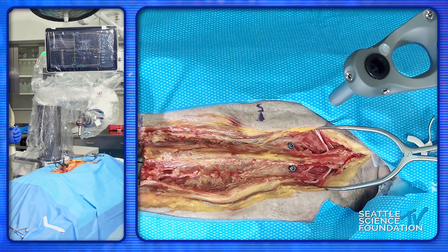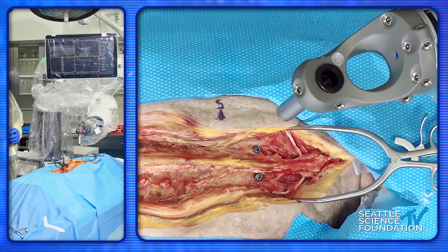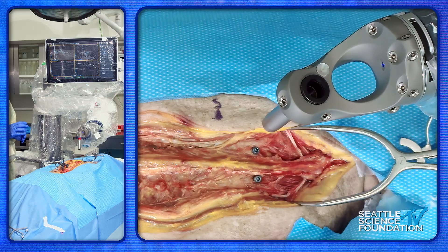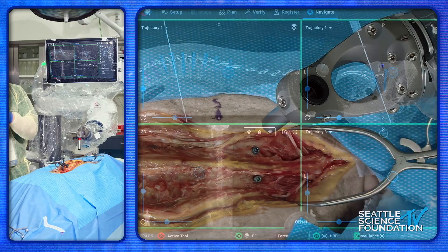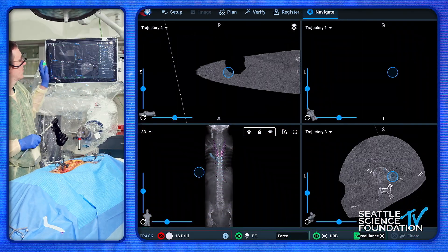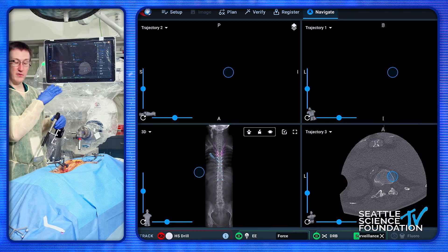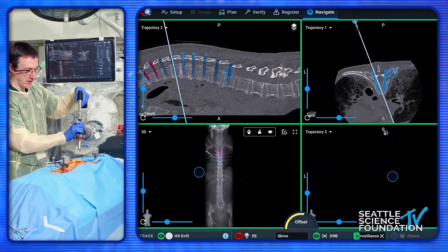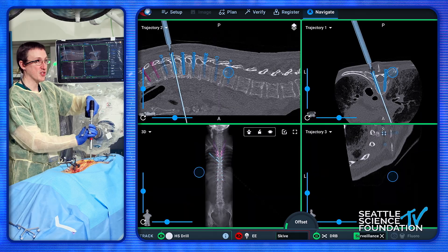There are times where the patient will be moved enough that you'll need to re-register, and it's important to be able to recognize that. Having the array in line with the camera the whole time allows you to figure that out. There are warning signals that will come up if the anatomy is grossly off; however, you're going to want to use some common sense there as well. You want the people around you to be very gentle.